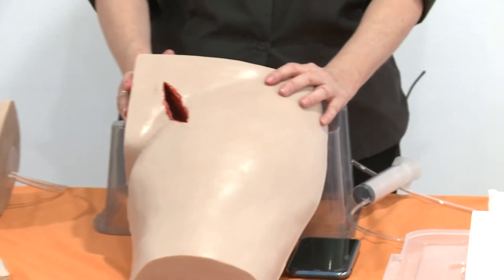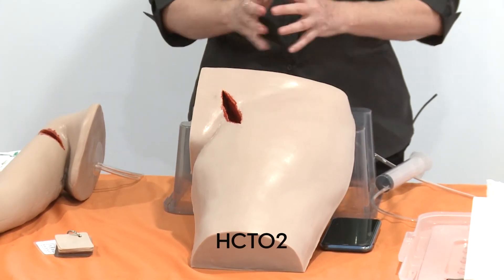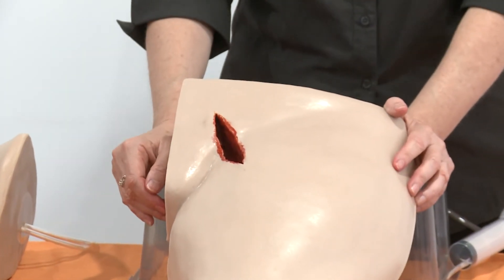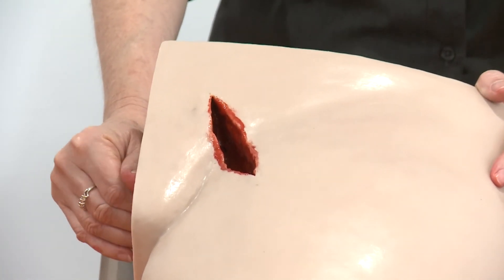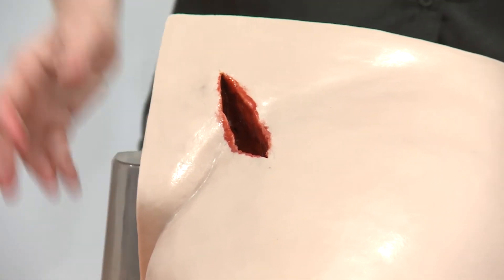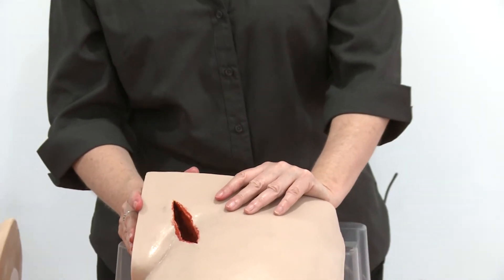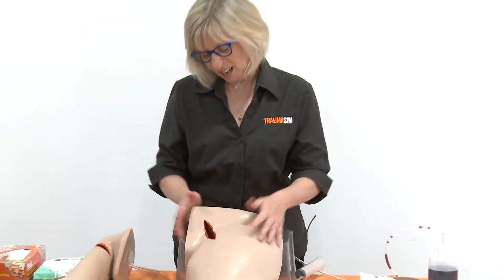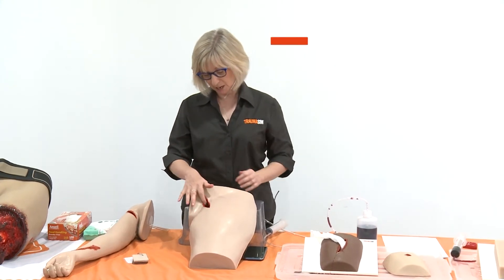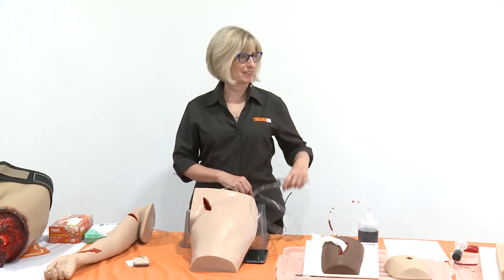Moving along — the thigh. This was the first haemostatic clotting trainer that we made, for the army, because at that stage they were using hindquarters of pork and all sorts of stuff. They wanted something big simulating a junctional wound — where a limb meets the body, so either an armpit wound or a groin wound. Those big life-threatening nasty things. He's got his femoral artery severed here and he bleeds exactly the same as the other trainers do.